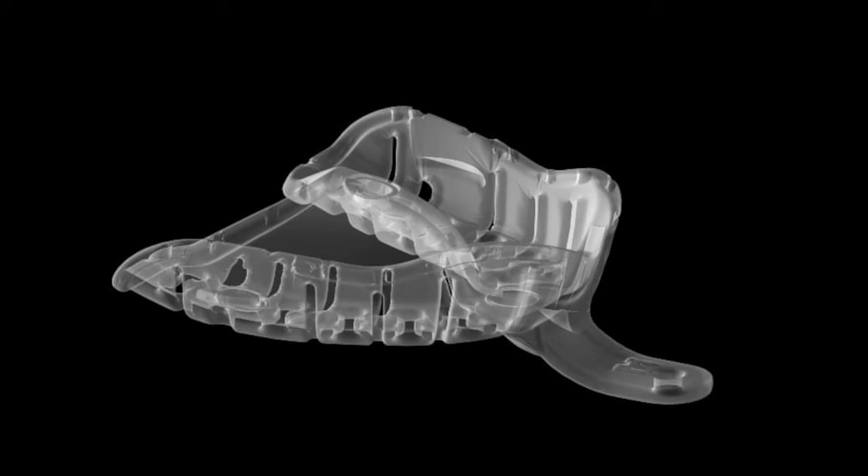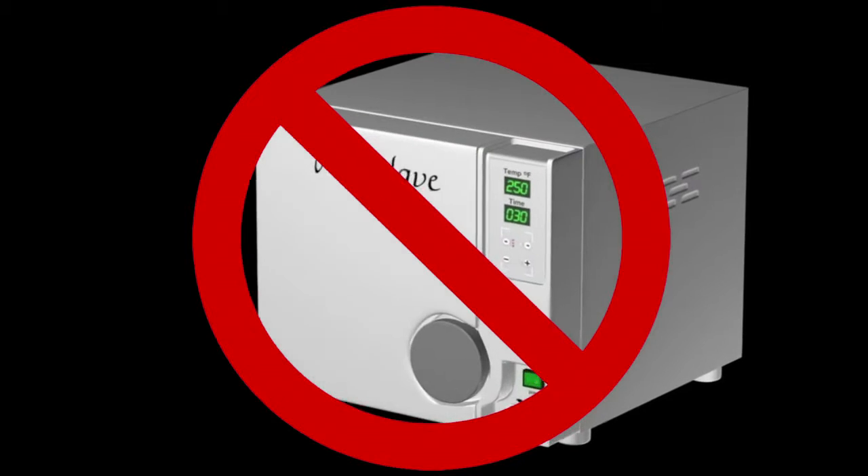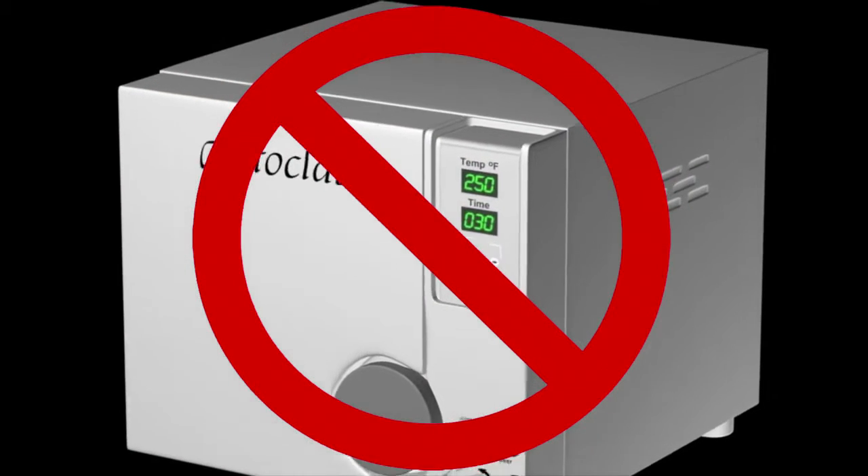This is possible by heat molding the tray intra-orally for an exact fit. The trays are disposable, intended for single use only. The trays should not be autoclaved due to their thermoplastic composition.